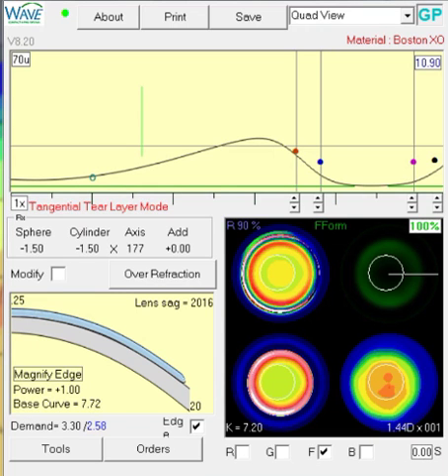In this orthokeratology case, we had previously moved the OZ and IC out a little bit farther to help this patient who was experiencing glare at nighttime. And now the patient still has some glare, but the bigger problem is we have undercorrected cylinder in the post-wear refraction. In the baseline refraction, we have about a diopter and a half. After lens wear, the patient still has about a diopter remaining, and that's causing blurred vision.